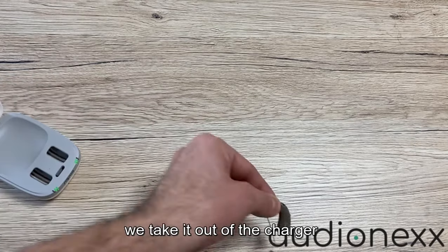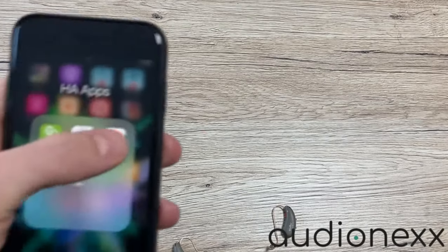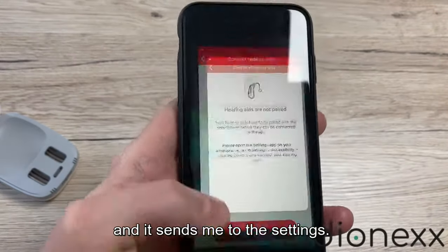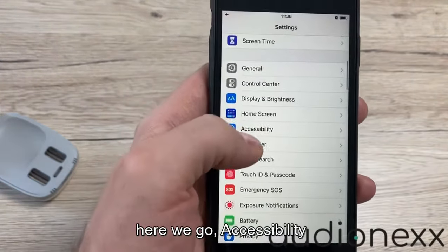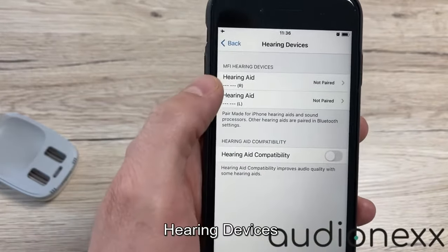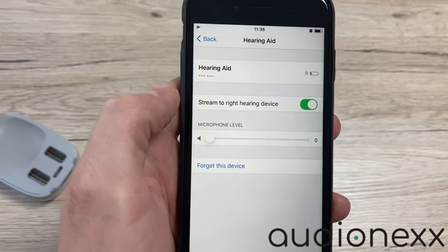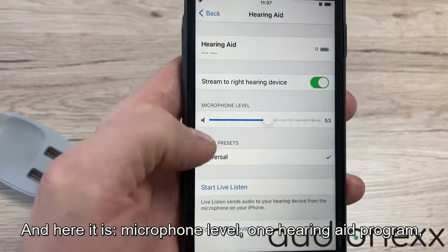We take it out of the charger and we go to our Signia app. It asks me how I want to connect the hearing aids — so Bluetooth — and it sends me to the settings. Accessibility, then Hearing Devices. Here you find the right and the left hearing aid, which is both fine. Let's pair the right one. And here it is: microphone level, one hearing aid program.